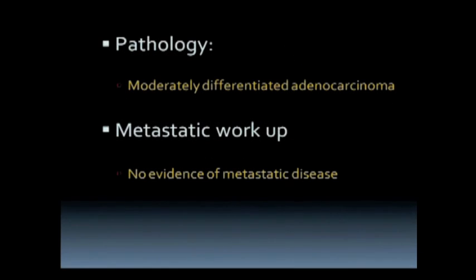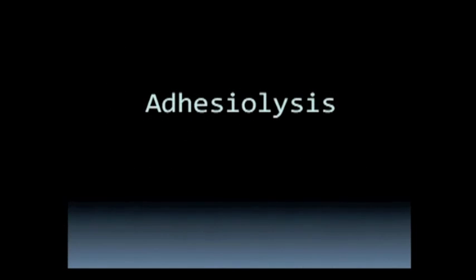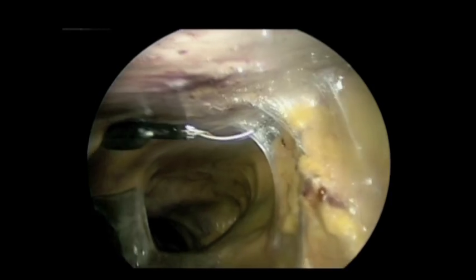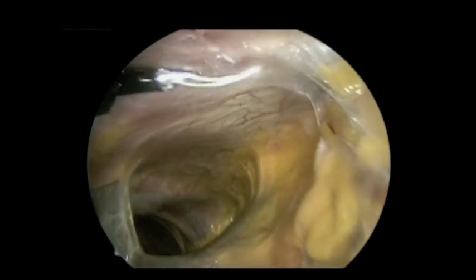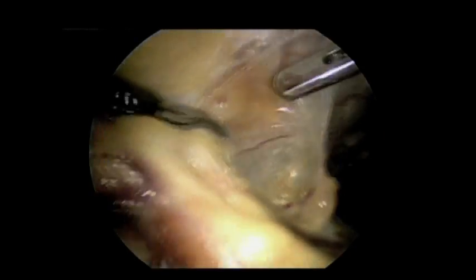A plan was made to take her to the operating room for a laparoscopic gastrectomy. We entered the abdomen using the open Hasson technique. Extensive adhesiolysis was done, as you can imagine, because the original surgery was open. We used a combination of cold scissors and energy source to accomplish the adhesiolysis.